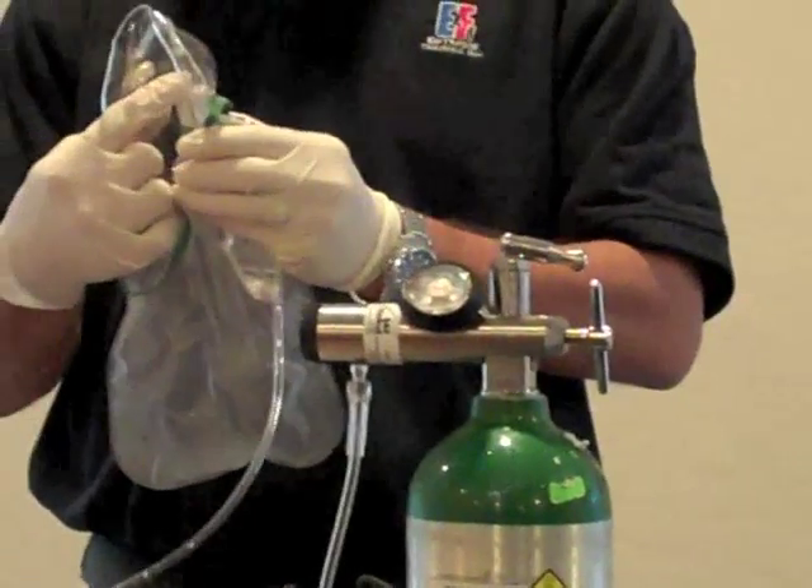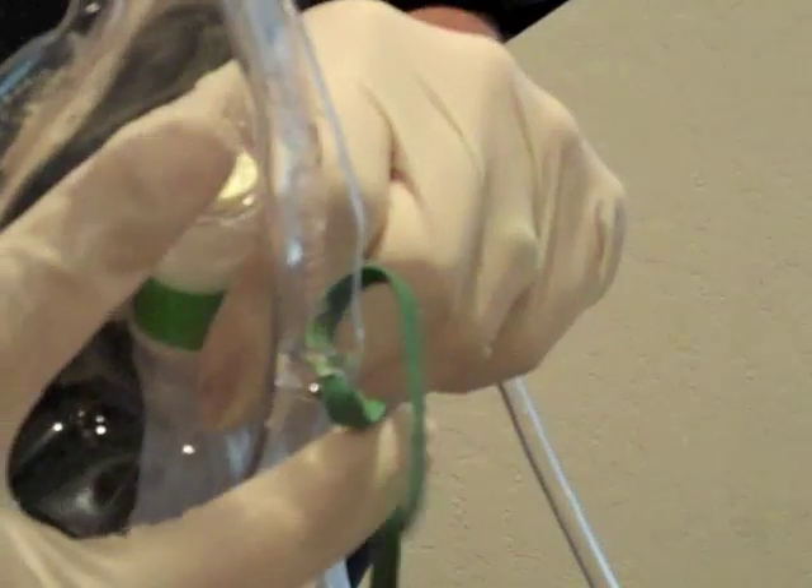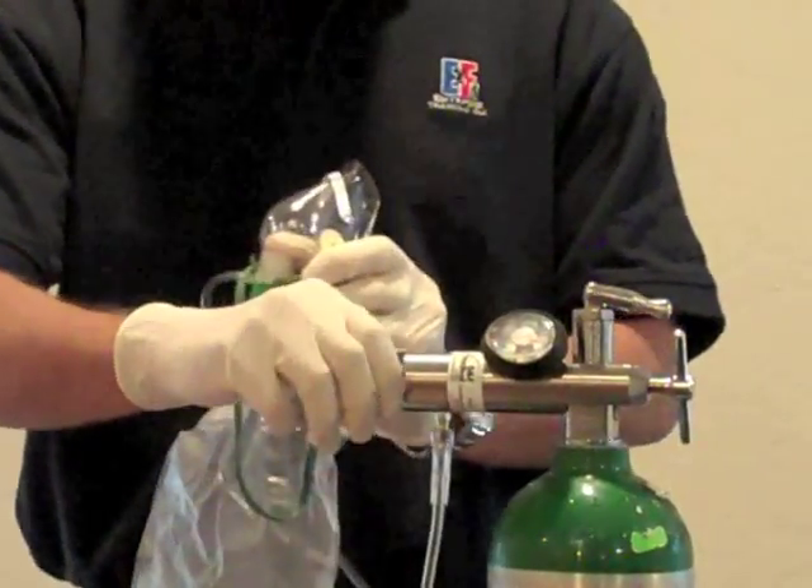Pre-fill the reservoir bag on the non-rebreather mask by placing a finger over the oxygen inlet hole and then opening the regulator. Adjust the regulator to 15 liters per minute.